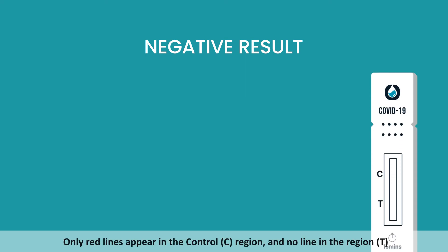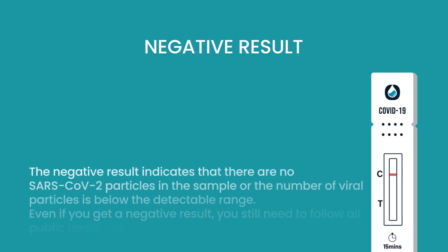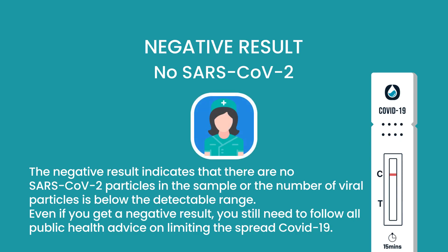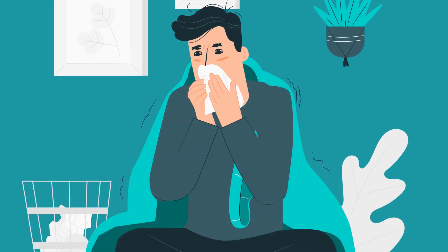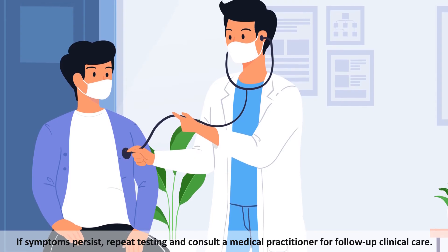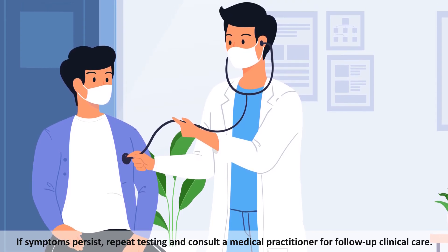Negative result: Only a red line appears in the control C region and no line in the region T. The negative result indicates that there are no SARS-CoV-2 particles in the sample, or the number of viral particles is below the detectable range. Even if you get a negative result, you still need to follow all public health advice on limiting the spread of COVID-19. If symptoms persist, repeat testing and consult a medical practitioner for follow-up clinical care.